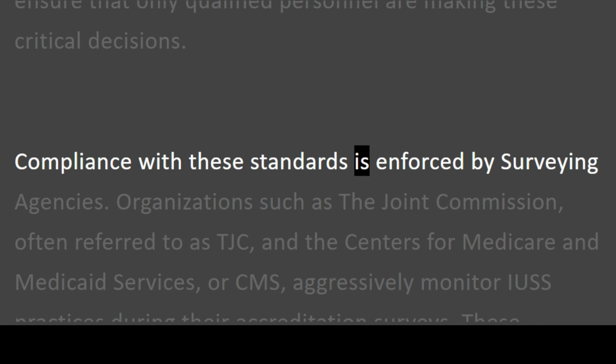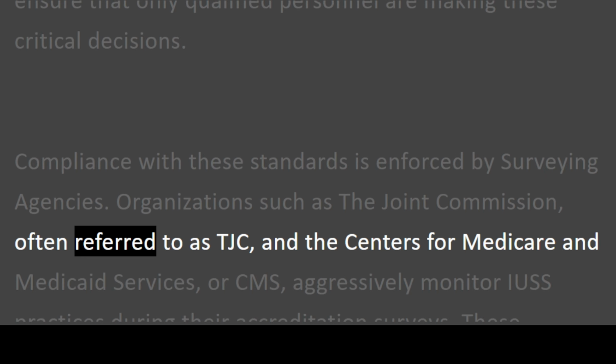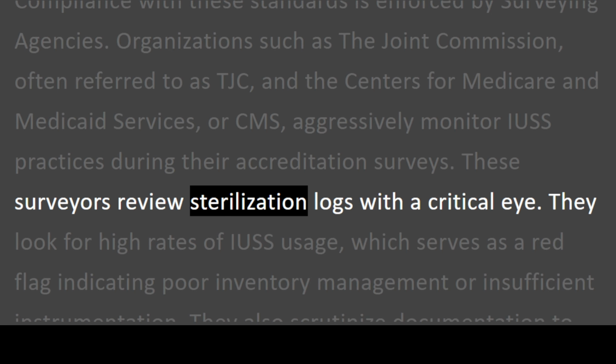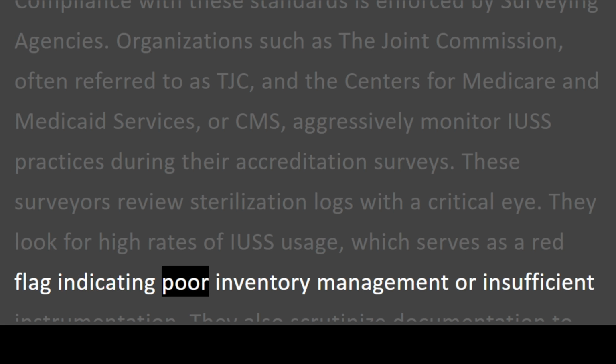Compliance with these standards is enforced by surveying agencies. Organizations such as the Joint Commission, often referred to as TJC, and the Centers for Medicare and Medicaid Services, or CMS, aggressively monitor IUSS practices during their accreditation surveys. These surveyors review sterilization logs with a critical eye.